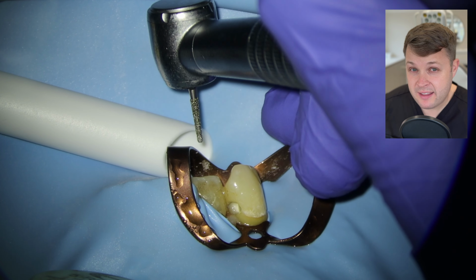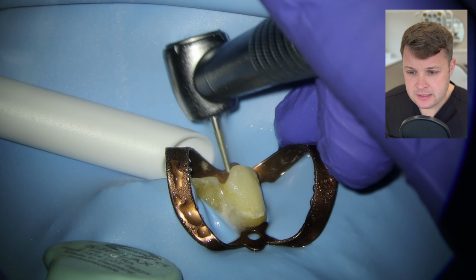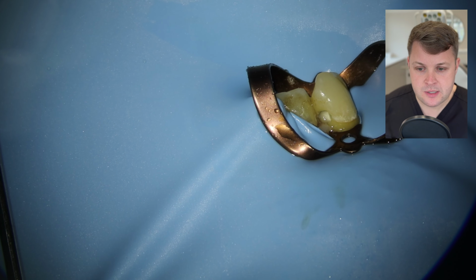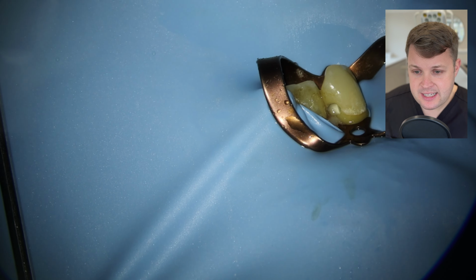And you'll notice again the hand file is ever so slightly bent. So I am concerned about this. When I look at this hand file, I can see that it is bent, so I'm going to just do a conventional access. I just think there's no point. But what you'll notice about this conventional access is that it's straight down the middle of the tooth, and we're not opening things up. So it's going to be a very, very narrow access, just so I can get straight line access with my hand files.